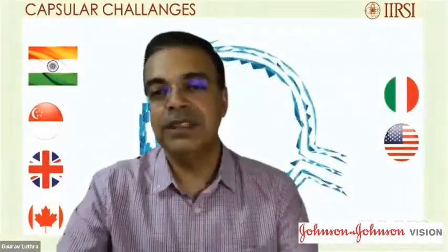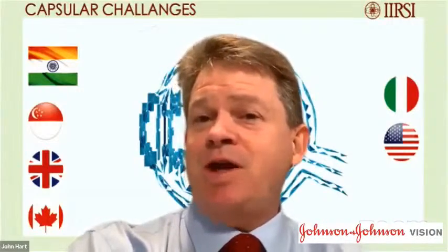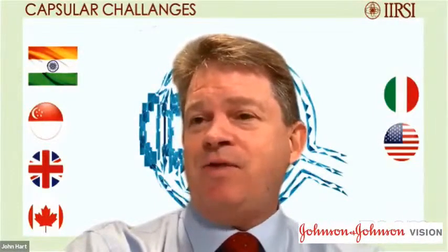Excellent tips, Dr. Lisa. And John, you wanted to chip in. Yeah, quick one. The idea of keeping the pressure higher in the anterior chamber is really important. There was actually a video at the ASCRS where somebody used an anterior chamber maintainer and worked through small incisions so that the pressure inside the anterior chamber was always higher, instead of using a viscoelastic or anything else. It's a really inexpensive, really easy way to get around the Argentine flag sign. So that's something to consider. Thanks, John. That's a nice tip as well.